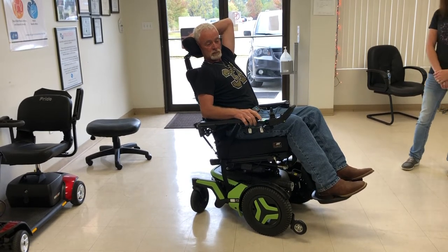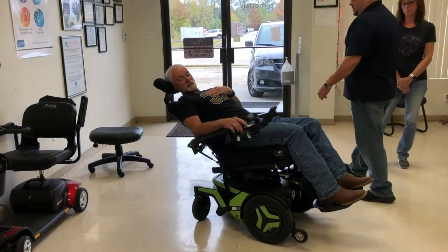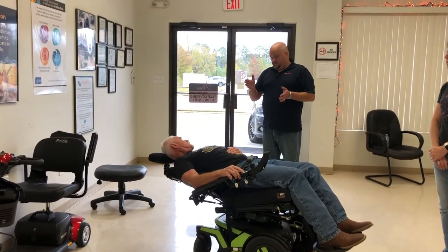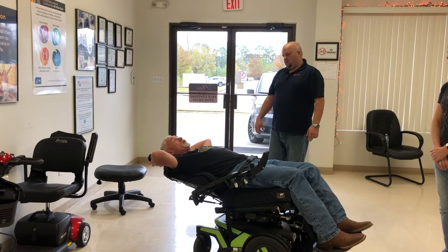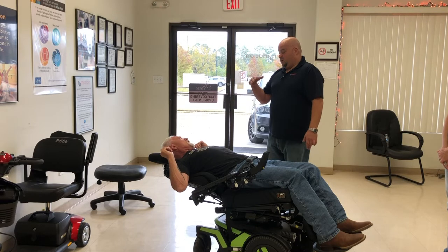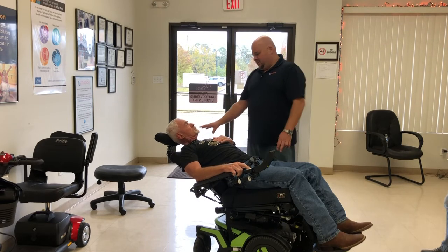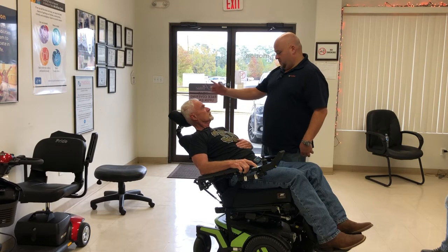You can also open up the seat-back angle. Let's see how much that headrest moves with recline. Yeah, you see with recline how it has that little bit of shear — your headrest moves a little bit. For the full recline position, I can adjust the headrest for that. We're also thinking that in this position someone could come and change your shirt. Combining tilt and recline together is going to give you optimal pressure relief — reclining and tilting at the same time.